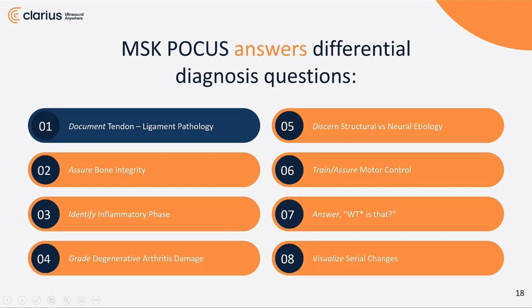I hope this case study has helped you better understand how musculoskeletal point-of-care ultrasound in the practice of physical therapy can be used to help refine down a differential diagnosis list into a more focused working diagnosis. This patient did get an MRI, which documented about 75% failure of her lateral collateral ligament, but the surgeon felt confident that there was enough fiber that remained to allow her to continue to function with stability over time.